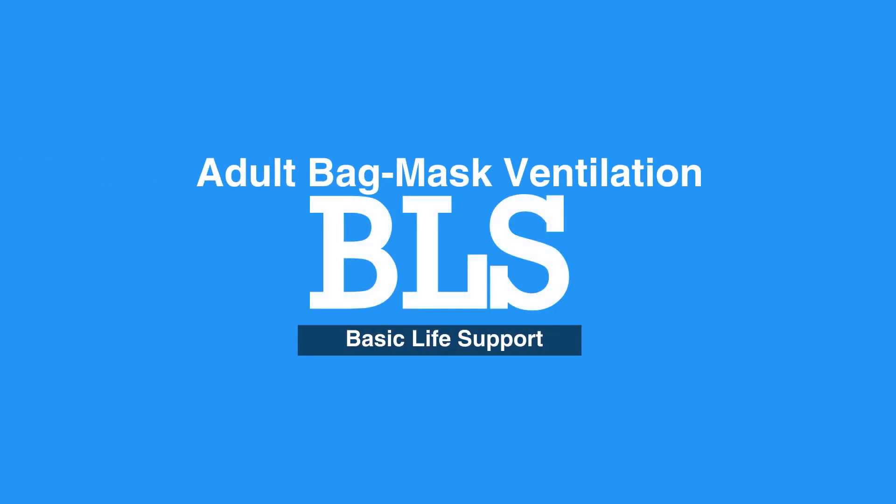Welcome to Adult Bag Mask Ventilation. In this video, we'll discuss the use of a bag mask to deliver breaths in two rescuers' CPR.